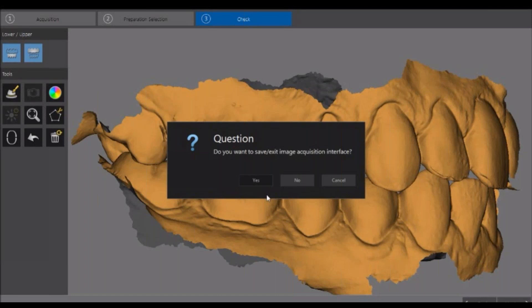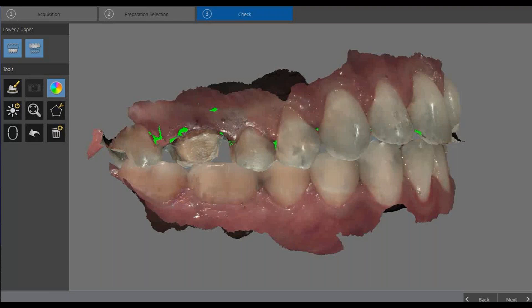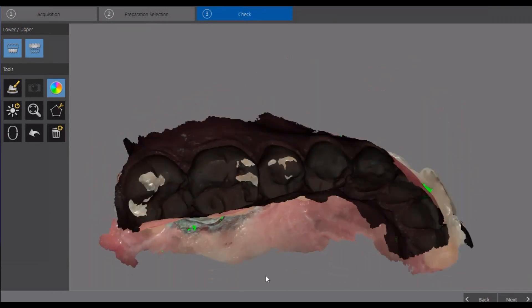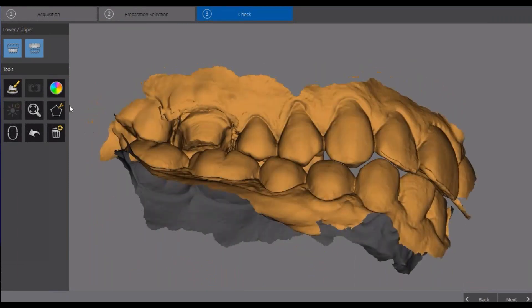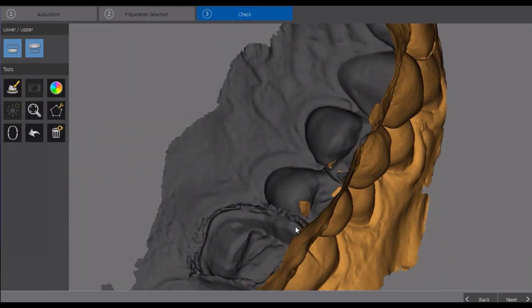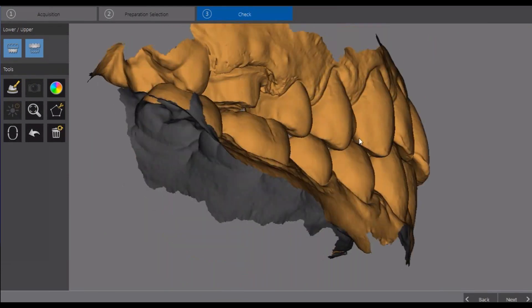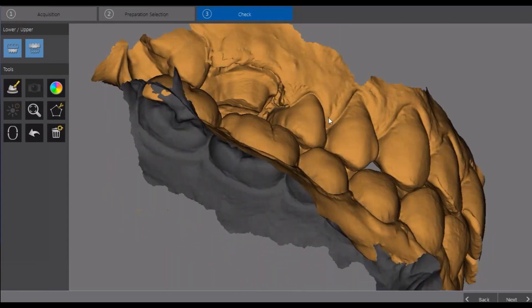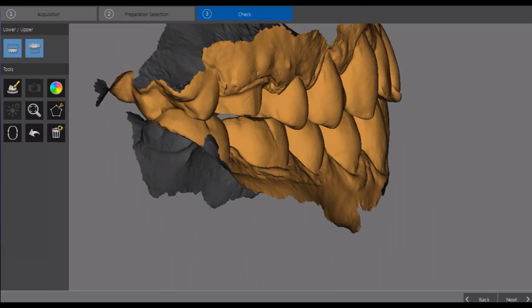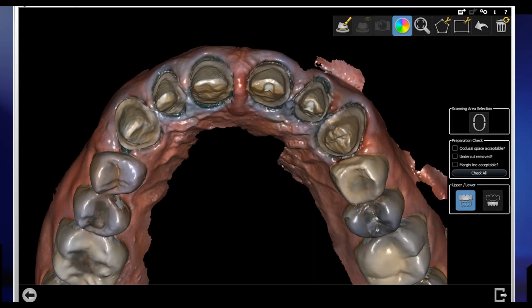The lab gets the images in color. Here's what happens with an optical scan — you can look at it in all different directions. One thing that was surprising when we started using this technology for crown and bridge dentistry was that the occlusion was actually more accurate than an analog technique. When you take an optical bite registration, the upper and lower models actually intersect because the PDL spaces are compressed when the patient bites down. That gives us a more accurate bite, so when we deliver our crowns, there's really not much occlusal adjustment needed.